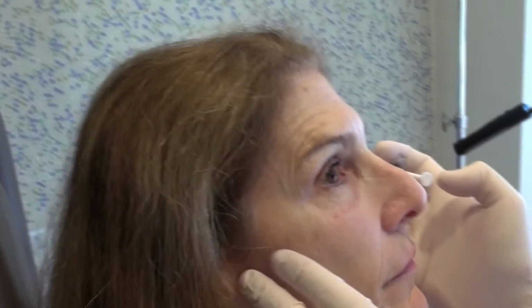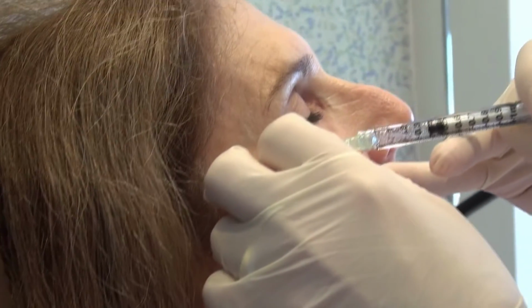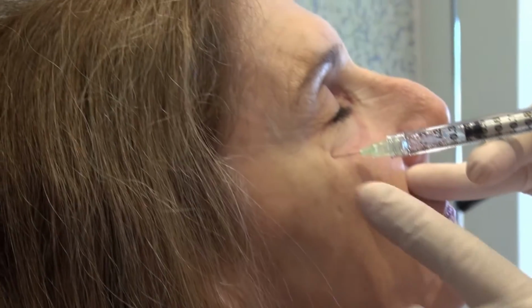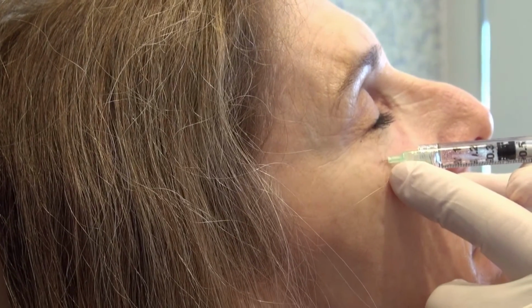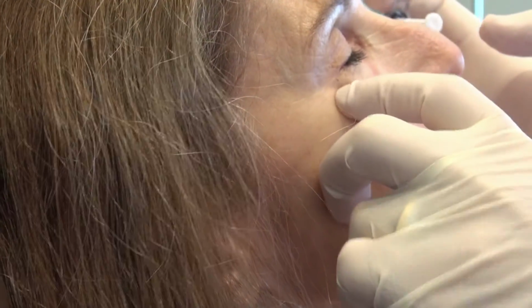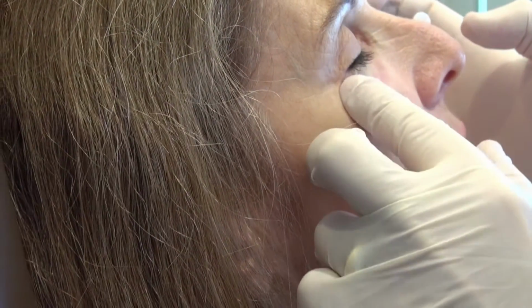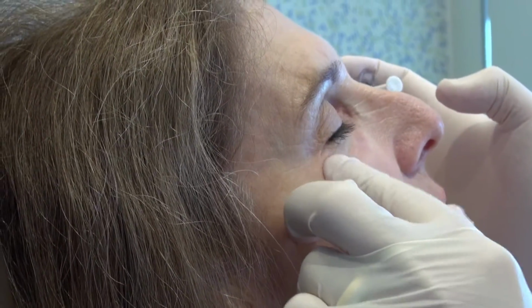Okay, open your eyes for a second. Good, that's much, much better. And you can see here that we're doing quite well. Turn this way. A little bit right over here, and then we should be all done. So, little stick here. Open your eyes. Good. So that's really nice.